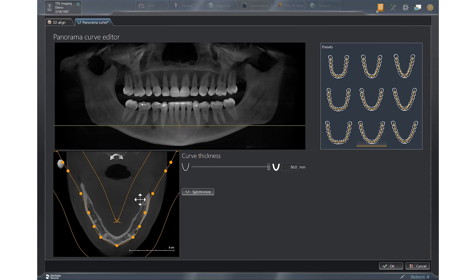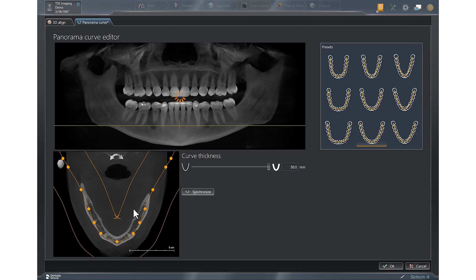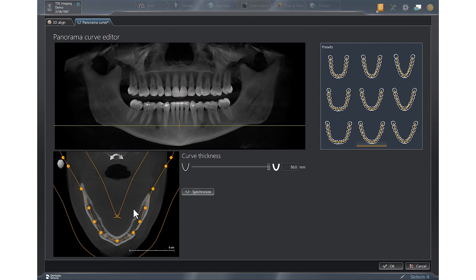If you want the teeth to be skinnier, you could left click and hold and bring that entire arch form up slightly, and you can see how that will narrow the teeth. Conversely, if you wanted to make the teeth larger, you could bring that down.